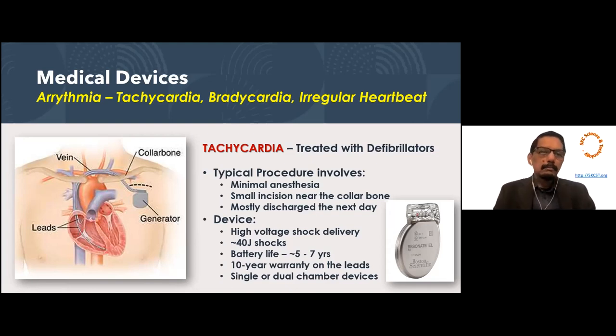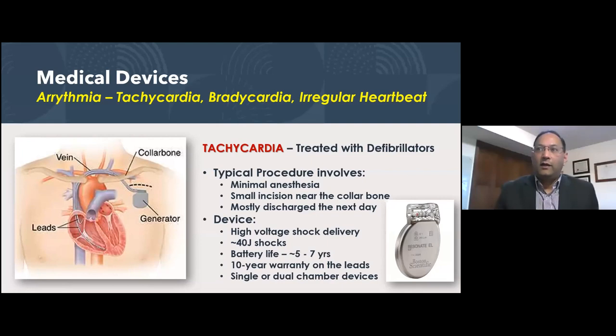Sometimes, because the patient is not needing it, a patient may even forget where the battery is at, right? You do get some kind of signal when the battery is low, you hear a beep. But elderly people may actually miss the beep, right? So the remote technology or remote monitoring is extremely helpful.